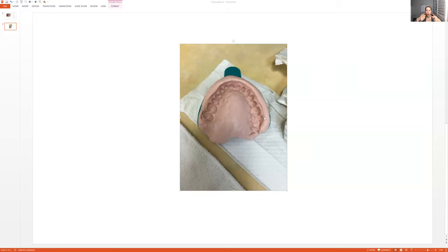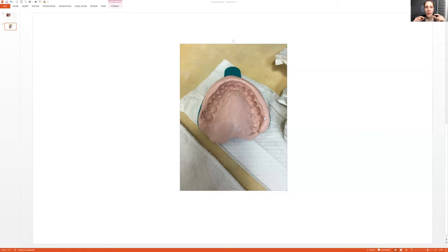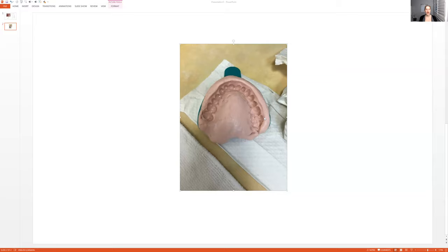Like that. And then over. So like this. Did everybody see that? Let me go a little bit closer. So take their lip out like this. Okay. That will mold their lip around it. You will get a perfect impression.